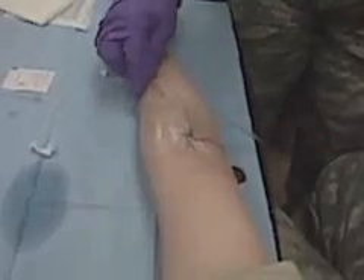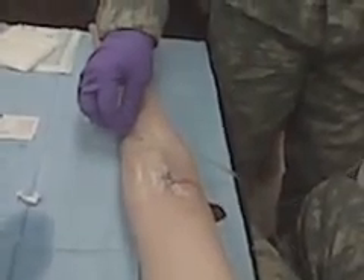I see some of you are having trouble with constricting the vein. A good way to do it — give me your arm. It's called the curry chop scorpion technique. You grab your pinky, put pressure on your arm, and with these two fingers you hold the hub. Pretty much. It's called the curry chop scorpion technique.